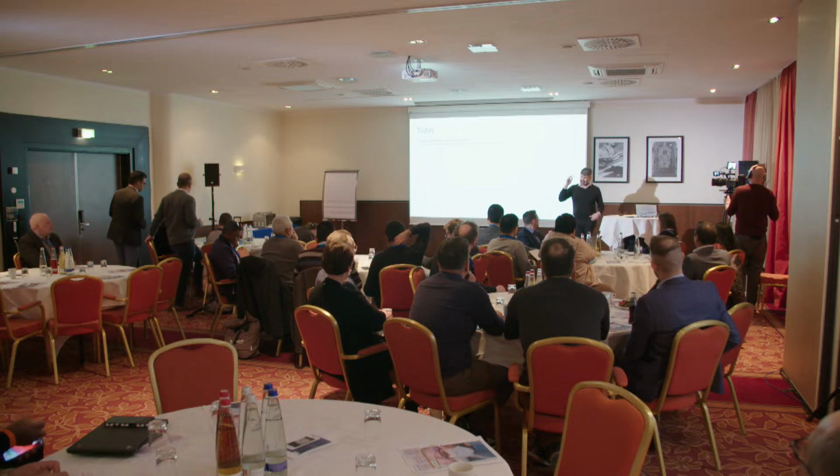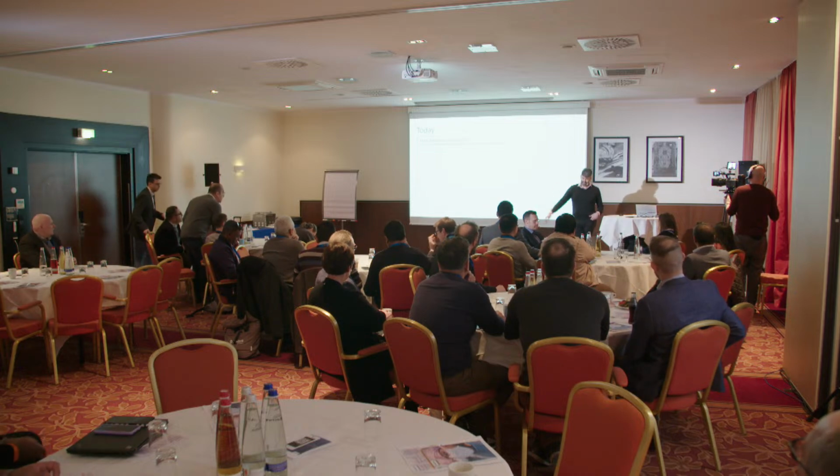My name's Narayan. I'm an interventional radiologist from St Thomas's in London, and I've got some friends and colleagues joining today to hopefully talk to you a little bit about IVUS, but not just IVUS itself, but also IVUS in the broader context of chronic limb-threatening ischemia, general PAD treatment. We've got 2.5 days of program lined up for you.